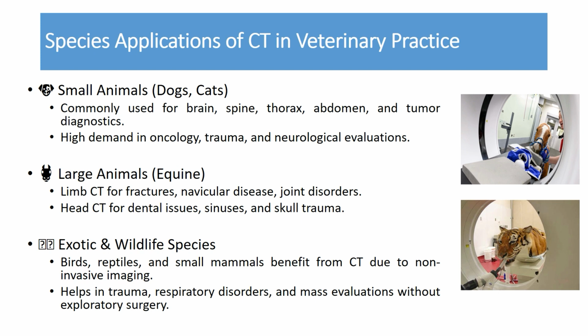Now, application of the CT in veterinary patients. For small animals, dogs and cats, it is commonly used for the brain, spinal cord, thorax, abdomen and tumor diagnostics. It can also be used for diagnosing any tumor or oncology case, in severe trauma cases, and in any neurological evaluation.